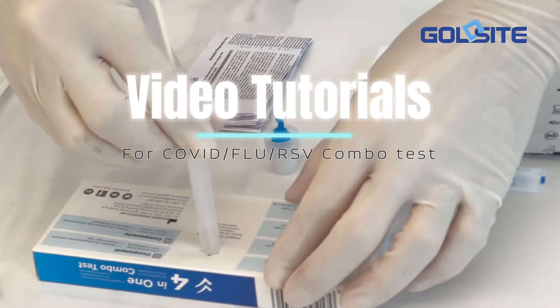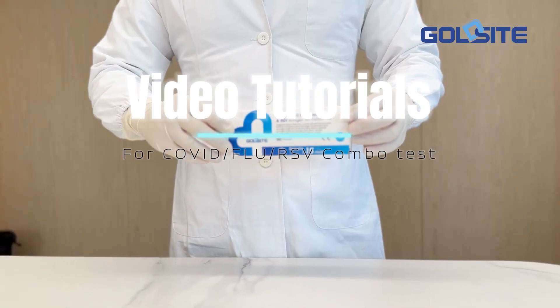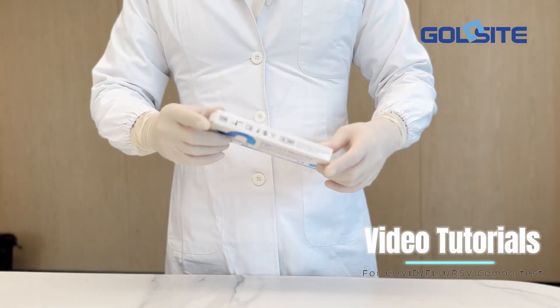Video tutorials for GoldSight COVID-19, Influenza, and RSV Combo Rapid Test Kit.